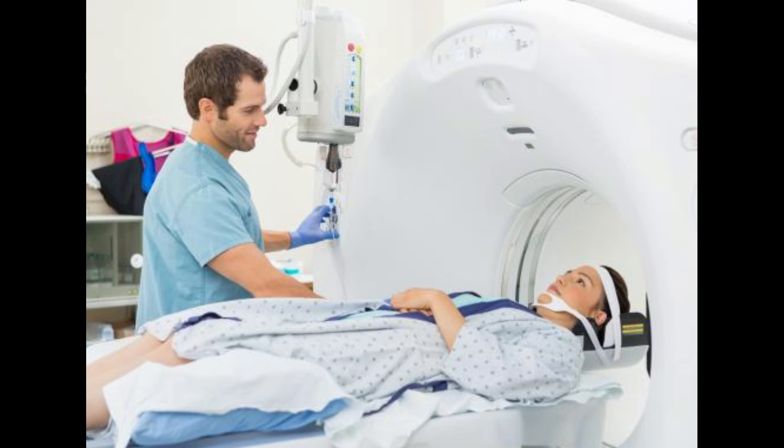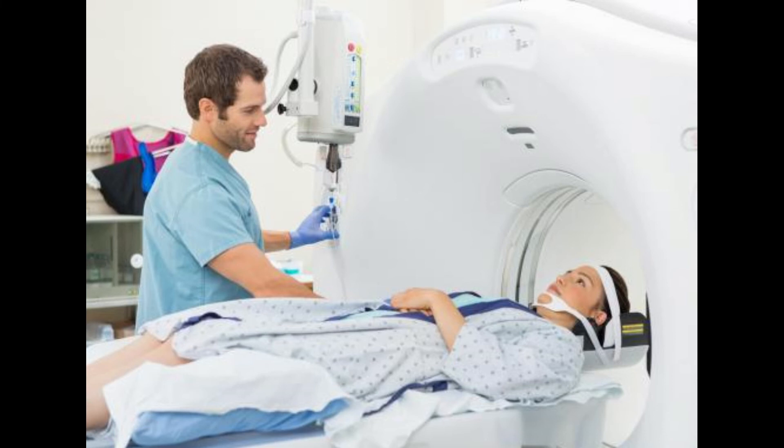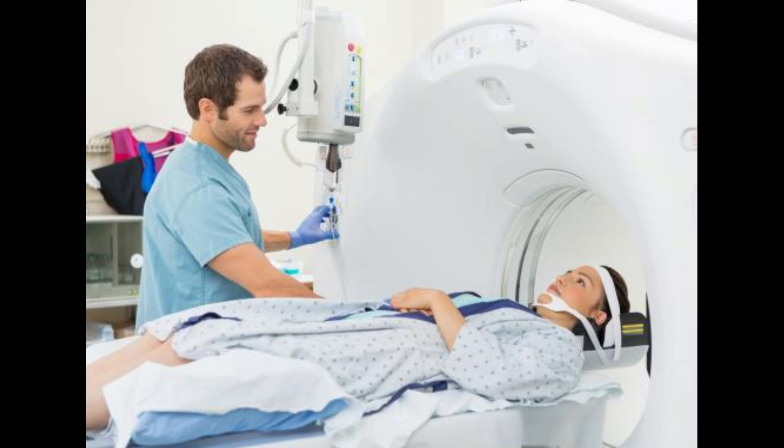Most PET scans are currently combined with CT scans to create images that provide detailed anatomical information about the organs and tissues. Results from PET CT scans typically give more accurate diagnostic and treatment information than PET scan results alone.